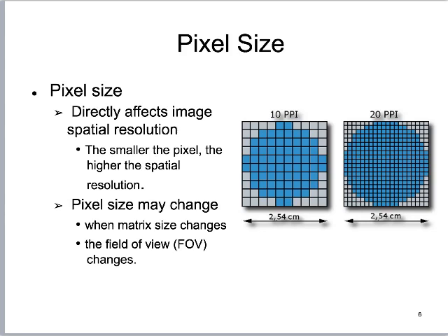And she's right. As we zoom in on the picture, what we're having to do is grow the pixels out. So spatially, as we zoom in, we're actually just making the pixels larger. And it appears to the human eye that we're getting closer. You could think about it like you're meeting someone in a dark bar, and across the bar, this person looks really good.